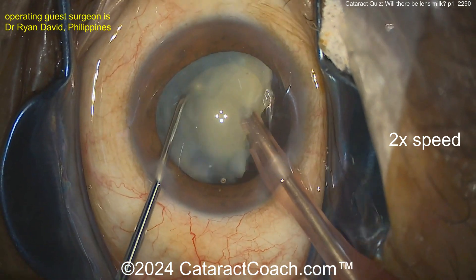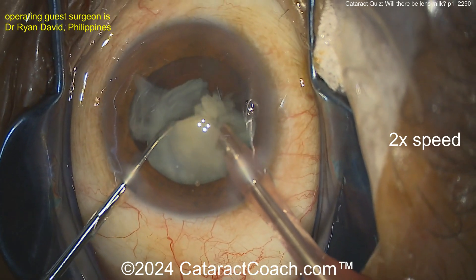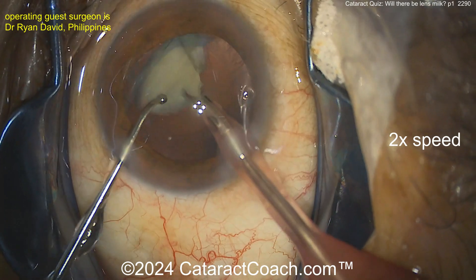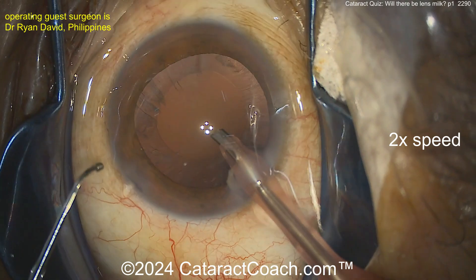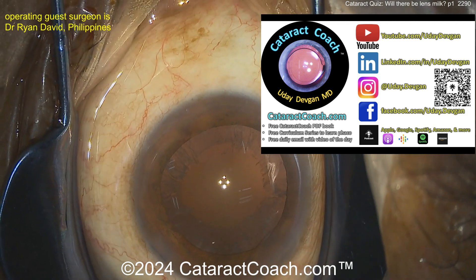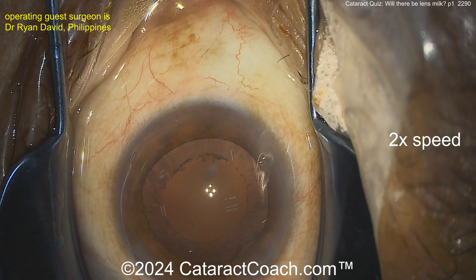Not much lens cortex was liquefied - you can see the lens cortex coming out with the epinuclear shell. I think sometimes you see this more often when the eye has been sitting there for longer. If they've had a white cataract for a very prolonged period of many years, sometimes they'll absorb some of the fluid and have less risk of Argentine flag sign. Whereas if they get a white cataract in a short period of time, you may have a highly pressurized bag. My trick is to touch the anterior lens capsule with the irrigation cannula - is it pressurized, is it bouncy?